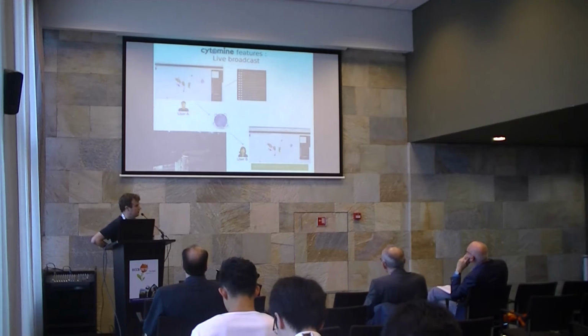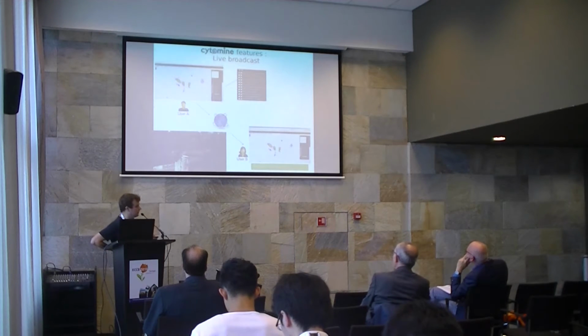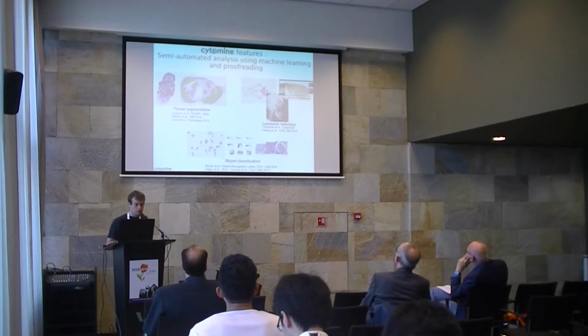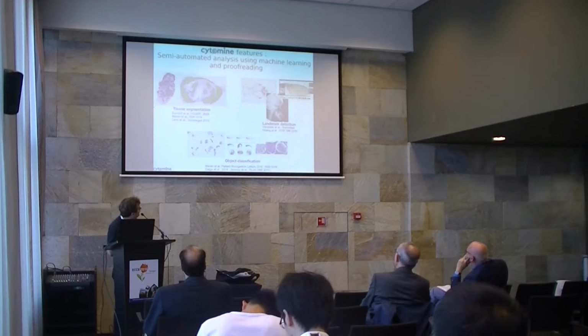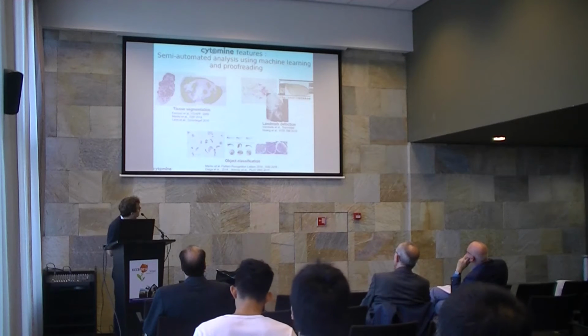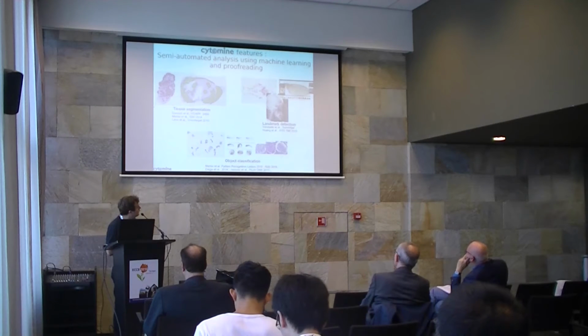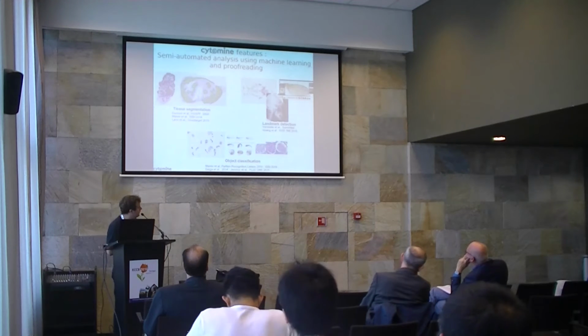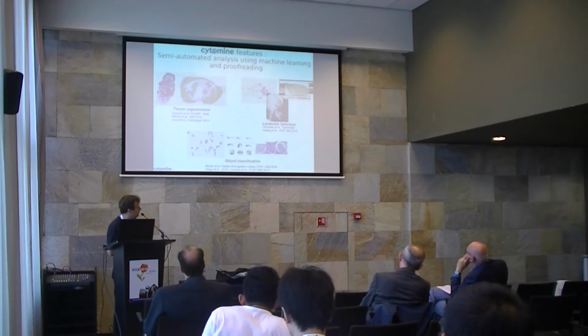Each user can be at any place, and so it avoids the old school way of sending digital slides by snail mail. We have implemented a few machine learning algorithms for different types of tasks. For tissue segmentation first, so we have applied it to several problems, but mostly to lung cancer recognition in animal models. We have implemented a landmark detection algorithm, and we have also implemented an object classification algorithm that we have applied to cervical cancer screening and also to glomeruli detection in renal biopsies.